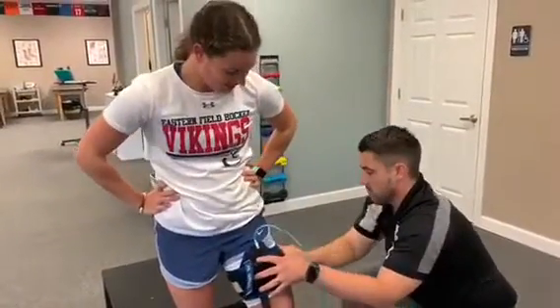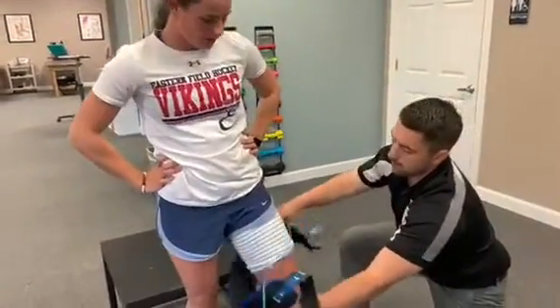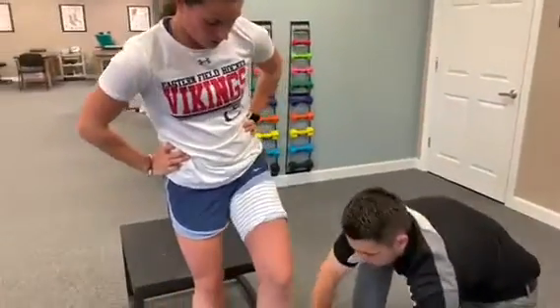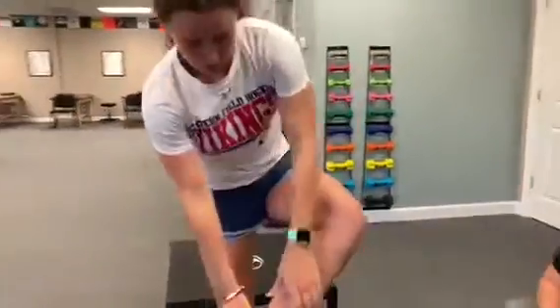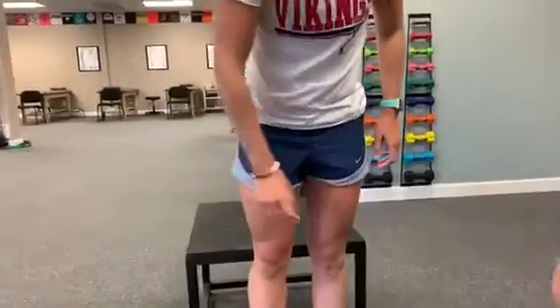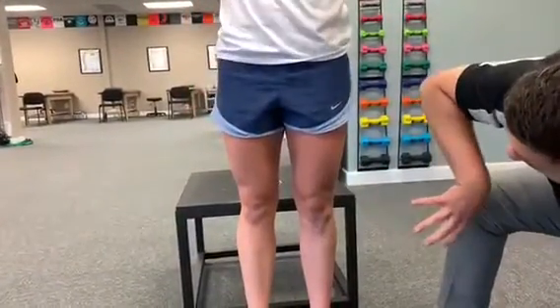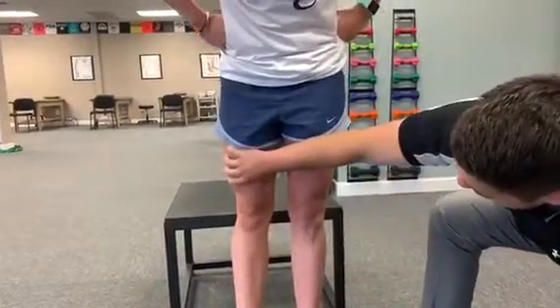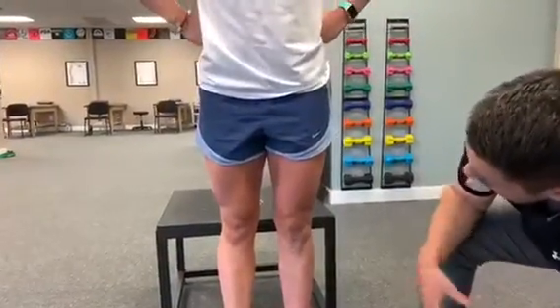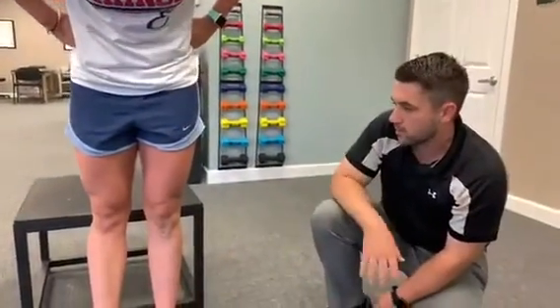We're going to show you the size of her quads — the workout leg versus the one that wasn't involved. As you can see, this is her non-dominant side that had the surgery. This side has been getting stronger and bigger, but she's still having struggles on this side. After a couple more weeks of this, we should be seeing close to the same size on both.